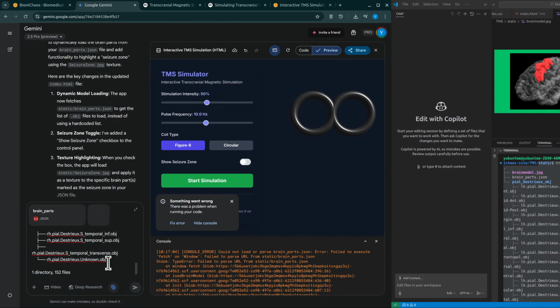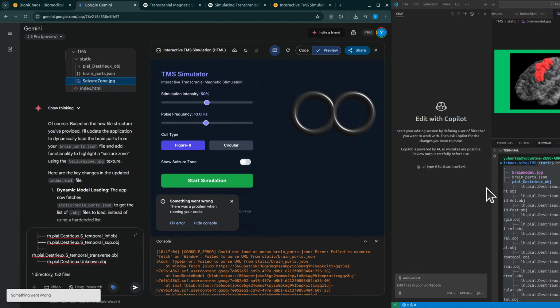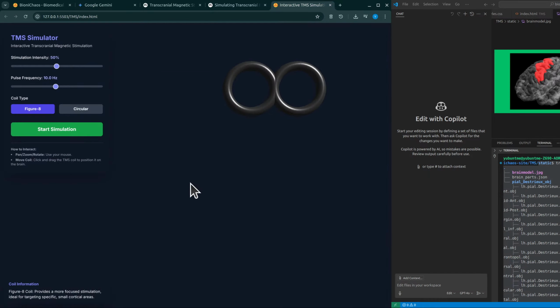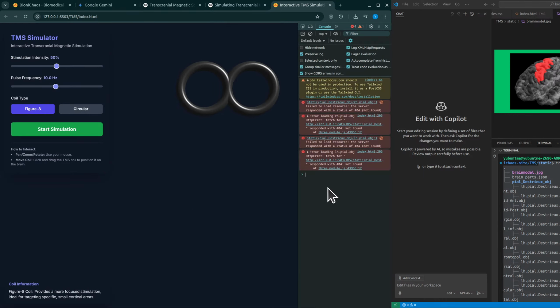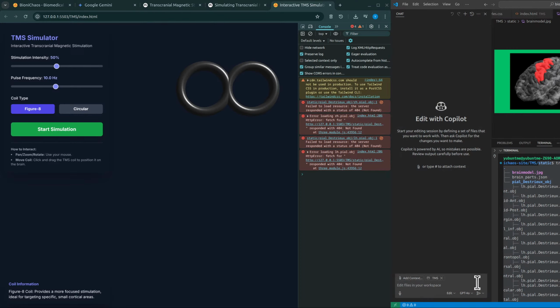Okay. So things like the scalp, the bone of the skull, the cerebrospinal fluid, the CSF that cushions the brain, gray matter where lots of computation happens, and white matter, which is more like the brain's wiring. All identified separately. Exactly. Each gets identified. And this is vital because, like we said, each one has its own unique electrical conductivity value. The sources stress that the accuracy of this segmentation is absolutely critical for the simulation to be realistic. I can see why. If you get the conductivity wrong, the E-field calculation will be off. Totally. Garbage in, garbage out, basically.